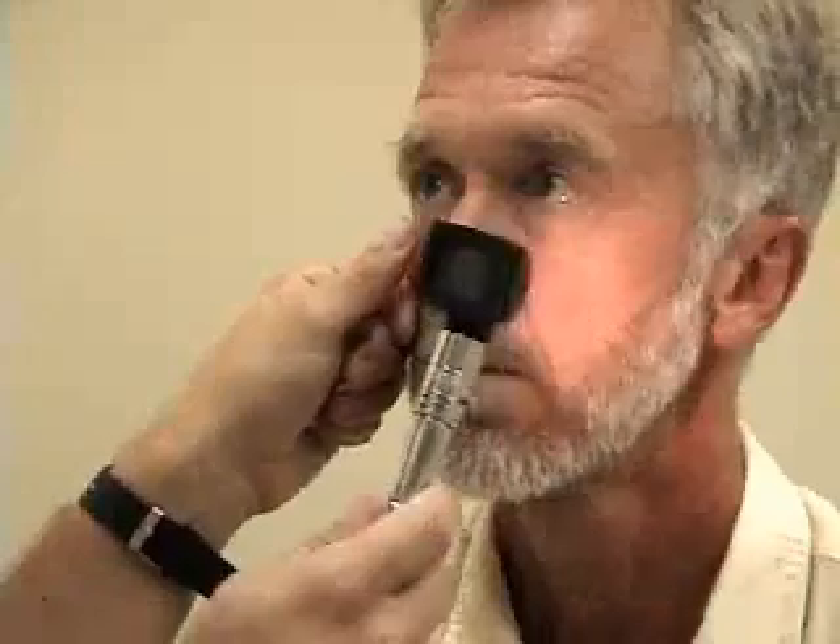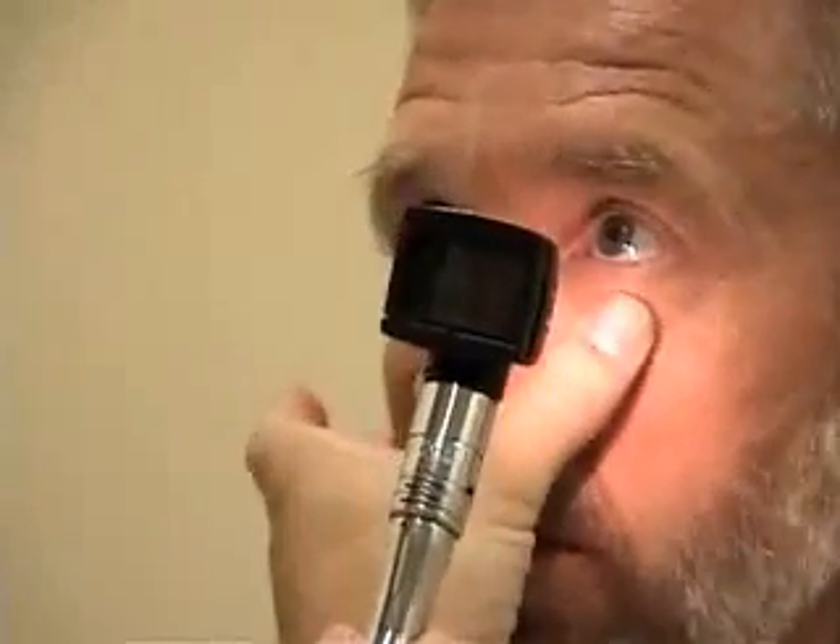Next we'll move to the eye exam. I'm going to start by having you look right at my nose. I'm going to lower the lower lid so I can inspect the conjunctiva. Now I'm going to turn the light up to look for his pupillary reflexes — looking right at my nose. I'm going to look both for the direct and the consensual response here, and do the same thing on the other side.